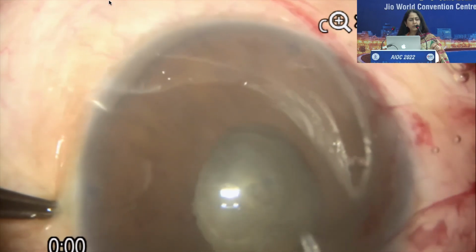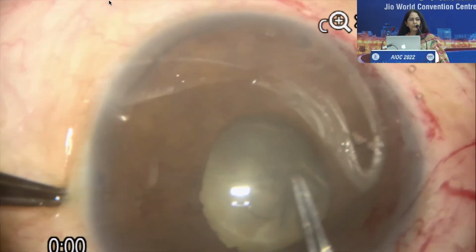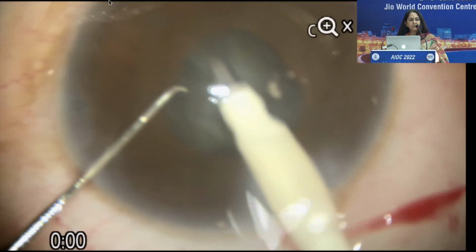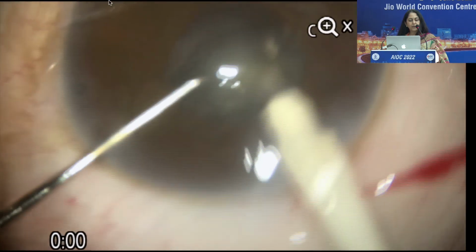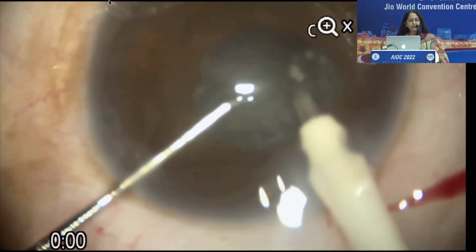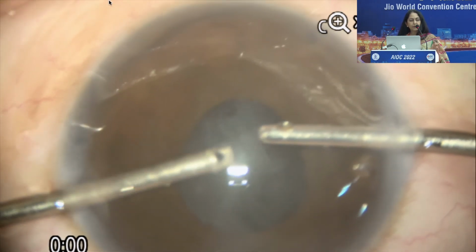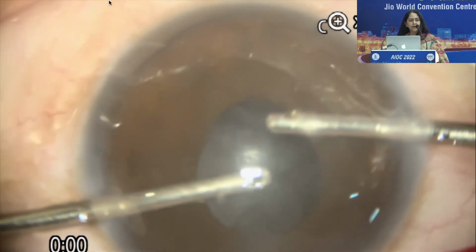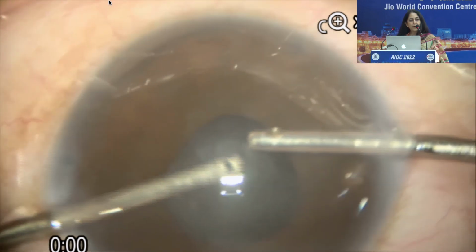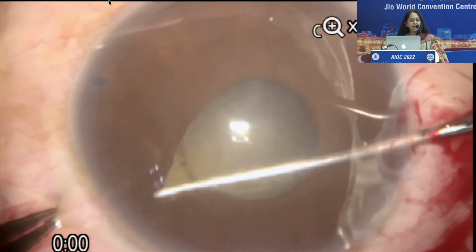So you do a rhexis which is smaller, but it has to go beyond the pupillary margin, because once you do that, you will realize that it is easier to hydrodissect also. And the important pearl while doing nucleotomy is to stay safe. These lenses sometimes are very sticky, they do not crack, but you need to just keep on teasing them and bringing them to the center. And cortical cleanup also becomes easier if you do a very successful circumferential systematic cleanup.